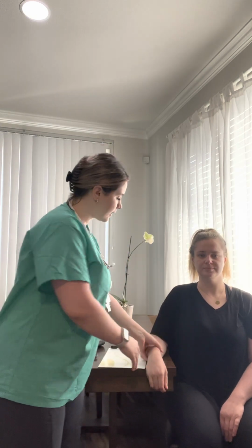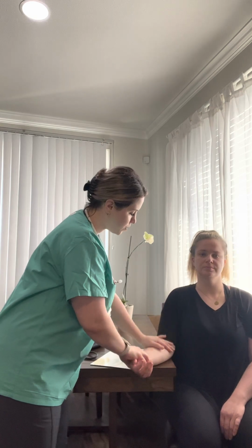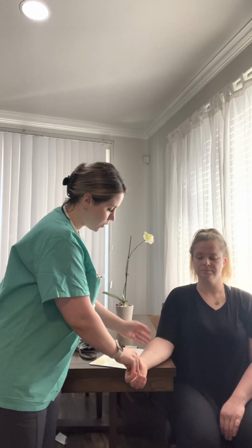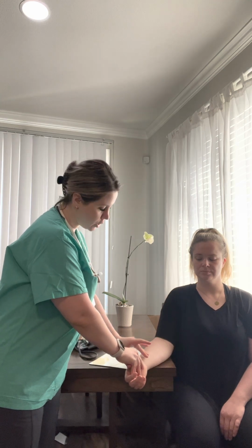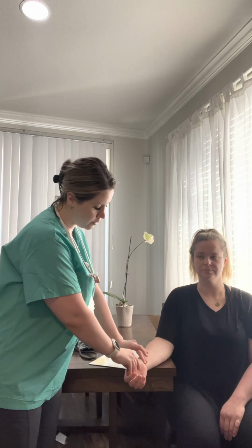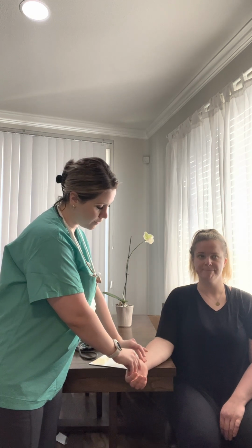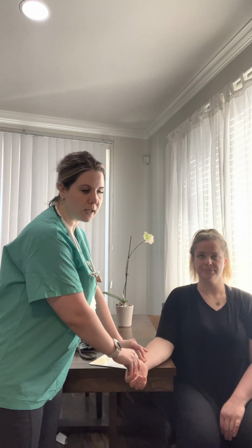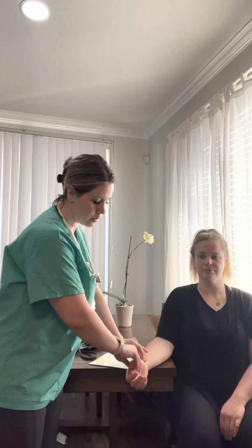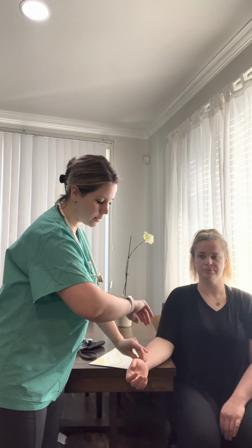Now that we have completed that, we're going to make sure that their arm is rested and relaxed on the table. We're going to take your radial pulse, and by doing so, we're going to put our two middle fingers on the radial artery. Once we assess the pulse and it's normalized, we're going to go ahead and count for 30 seconds.